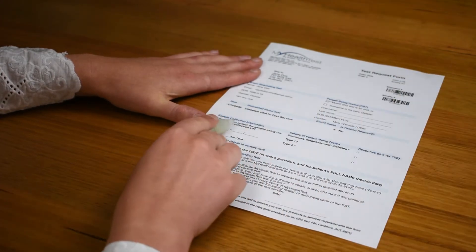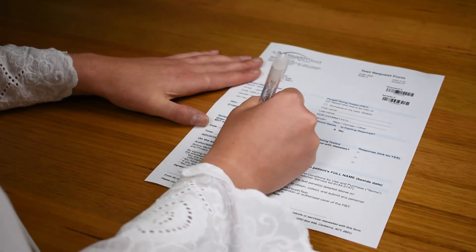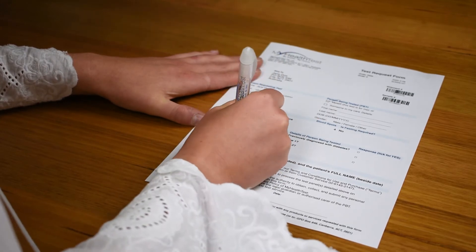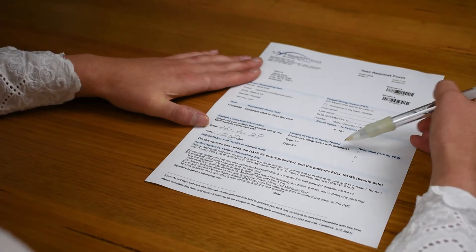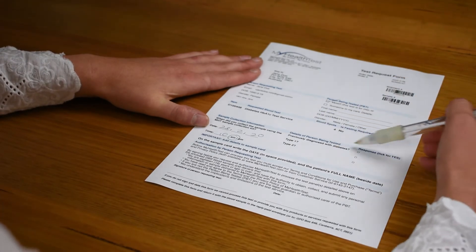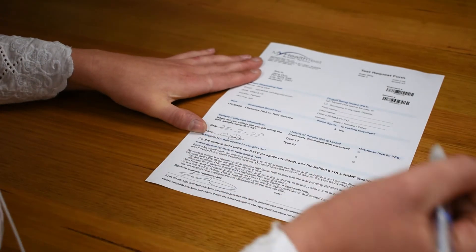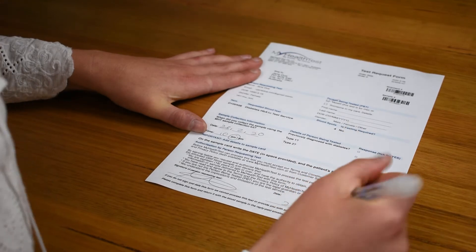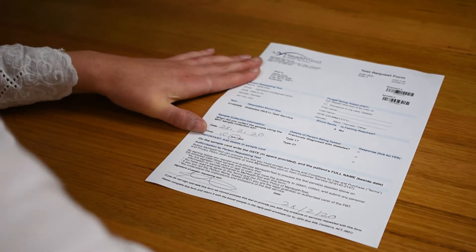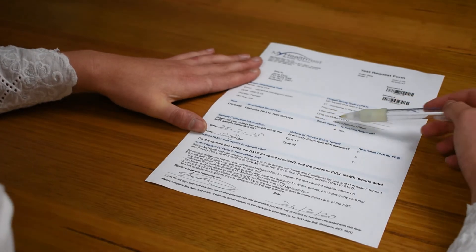You then want to fill in the sample collection information — the time and the date that you're collecting your sample. Pay attention to the details of the person being tested and answer the questions if they apply to you. Lastly, sign your form — this gives us authorization to process your sample; without this we can't process. Also pay attention to the number of blood spots required to perform your test.